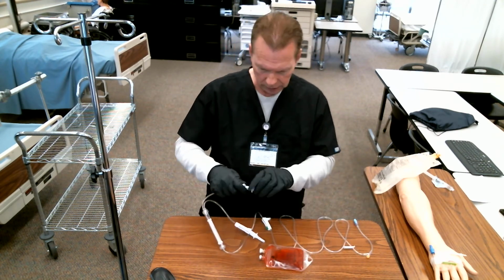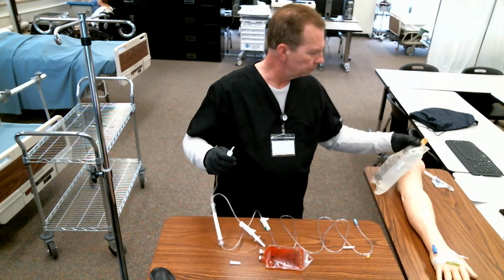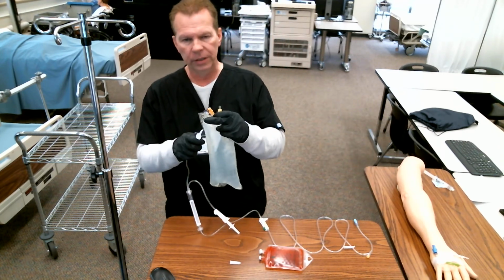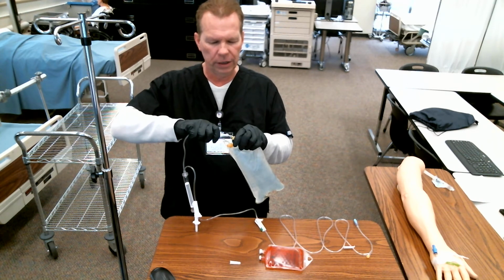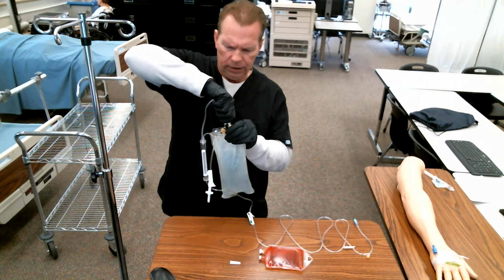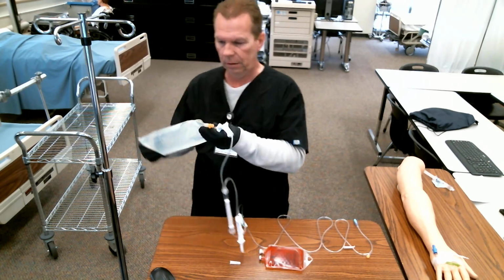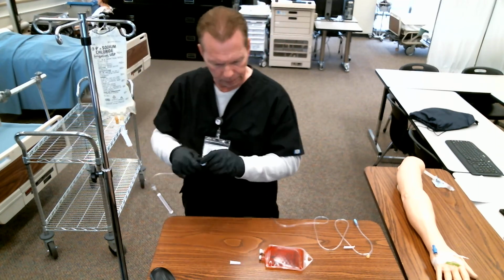Okay, and I'm going to go ahead and spike my saline. So I've got saline. This is sterile when I pull the top off. So you want to make sure you don't touch those with anything unsterile and bring those 2 sterile ends together. All right, and hang it up. There, so now I've got my saline.